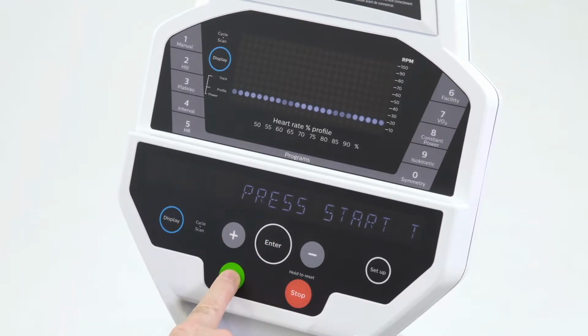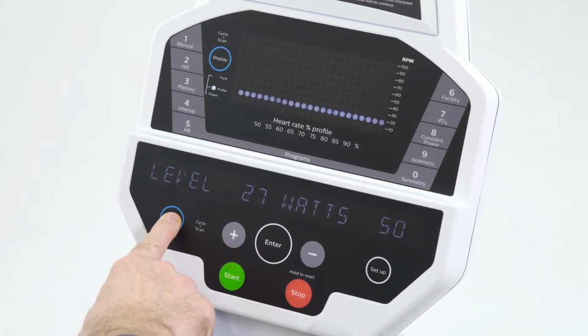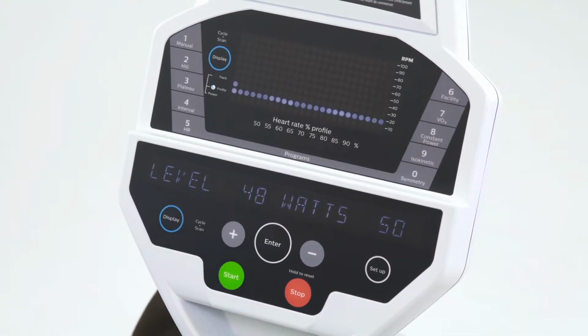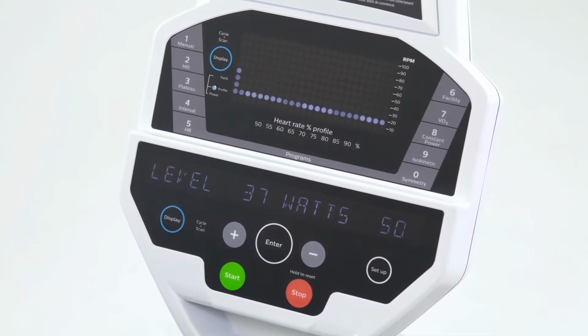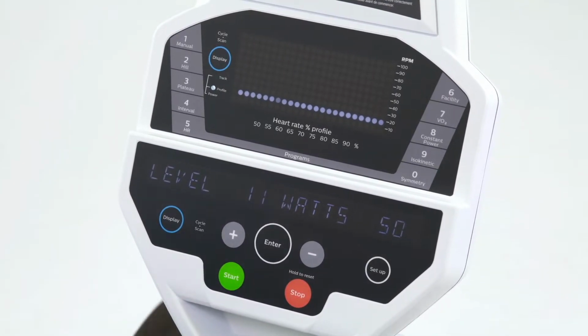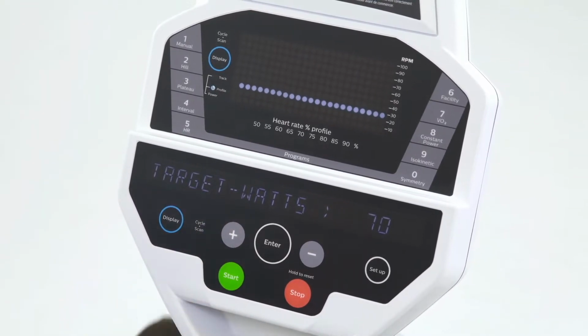It's a safety concern. So now when I press start, I am now in a constant power mode where when I look at my power, I want it to be 50 watts. But if I'm well below the RPM I need to be, I'll have a high resistance. If I start to increase my pedal speed, the resistance will drop and will try to keep me at 50 watts. So the whole purpose of this program is to keep the user at a level of 50 watts. We can increase the watt levels during the program by pressing the up or down key.